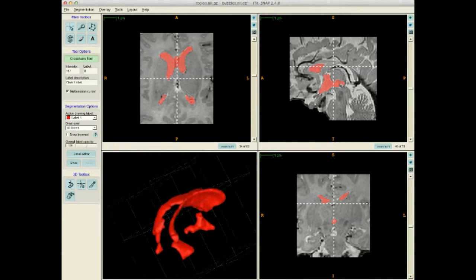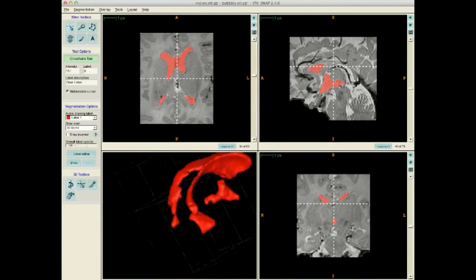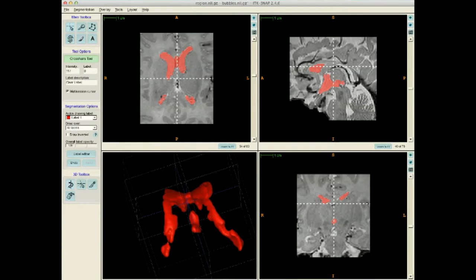Rotates, and the right is to zoom in, zoom out, and the middle button is just to pan the segmentation. Now, if you have a mouse, that would be much easier to do. So that's just the 3D trackball, this function, this mode. Then if you click the keys, this mode is 3D navigation.